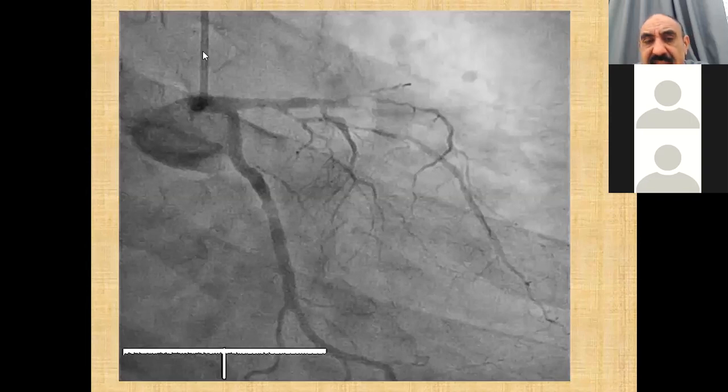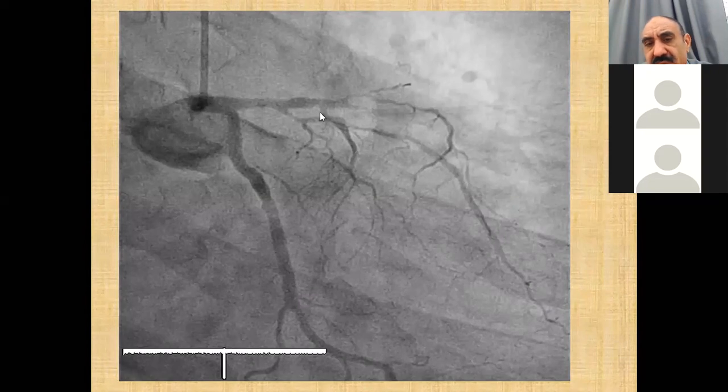We did a cath, but cath is done on a semi-elective basis. This is a catheter, probably a radial approach, showing a short left main and the circumflex artery, which is diseased in the groove. And this is the LAD proximally, there is mild disease. And after a good size second septal, there is complete occlusion of the left anterior descending artery.